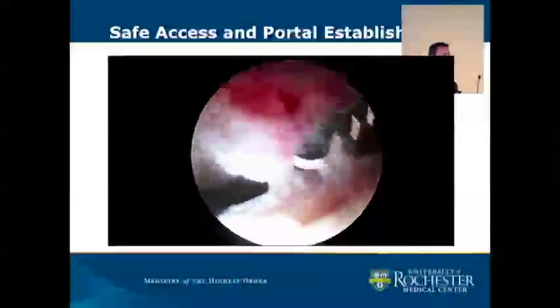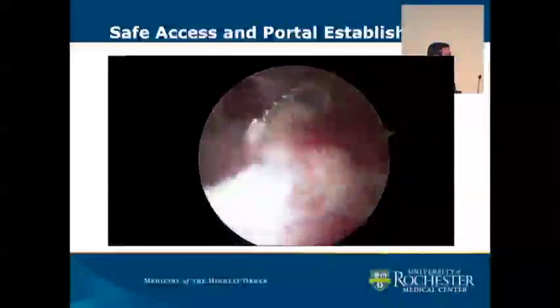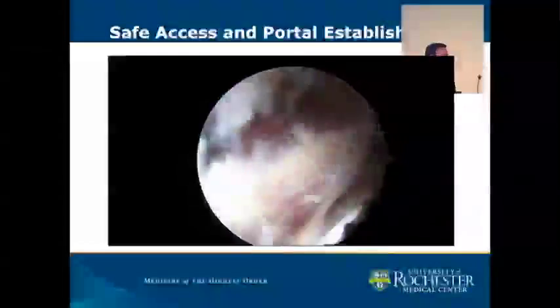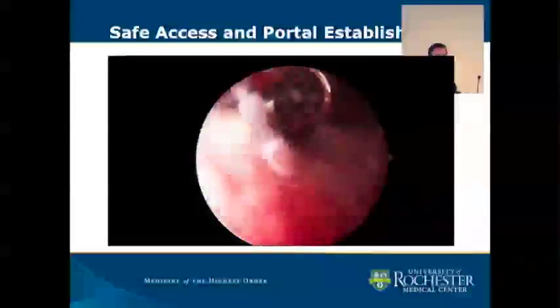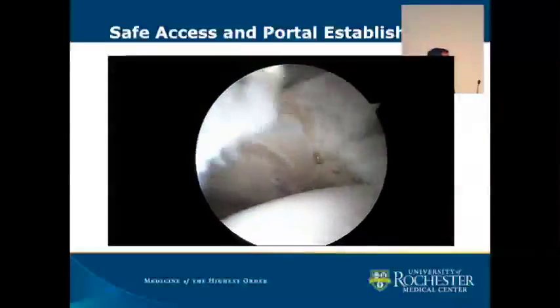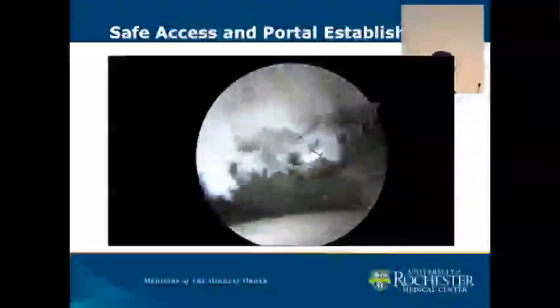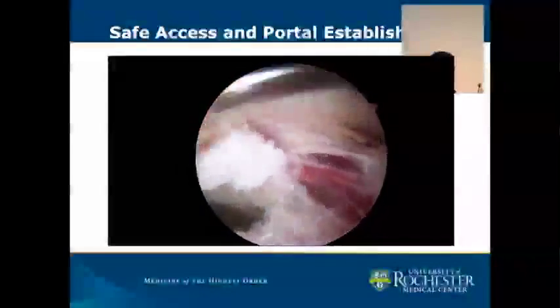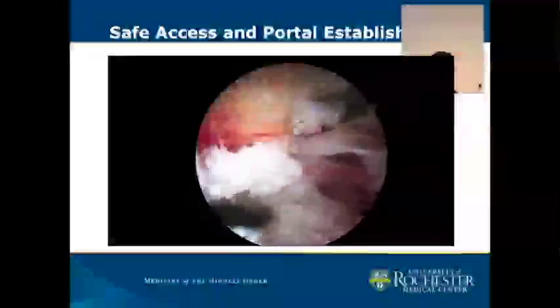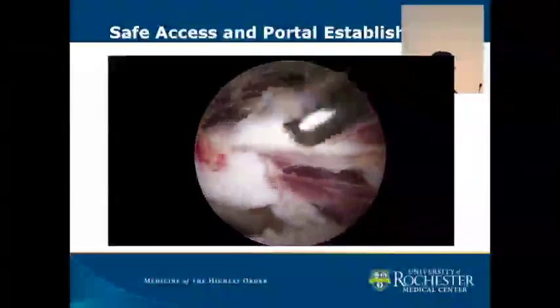There is a true space outside of the capsule. You think about it like an open joint surgeon. You can develop that space, and it allows you to retain more capsular tissue to repair at the end. You're sort of obligated to remove some of that deeper capsular tissue around the labrum for intracapsular work, but you can usually keep the rest. That's the direct head of the rectus right there, which is a good landmark.